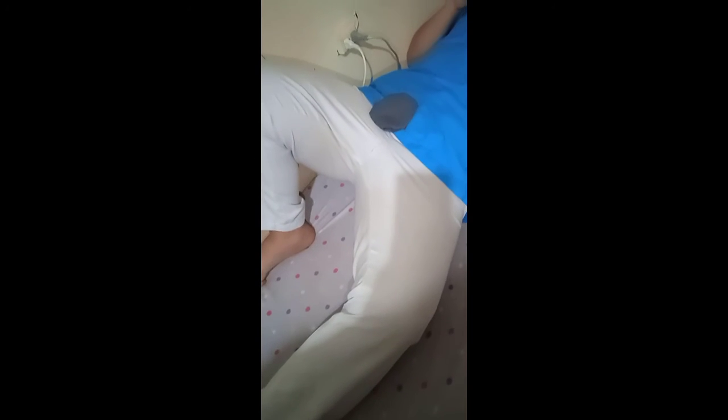And make sure that we will collimate closely on both sides to the femur with the end collimation to the IR borders. I will start to collimate. Ma'am, don't move, okay? Again, for the central ray, it should be perpendicular to the femur and to the IR, which will be directed to the midpoint of the IR. Right now, we will collimate the anatomy of interest.